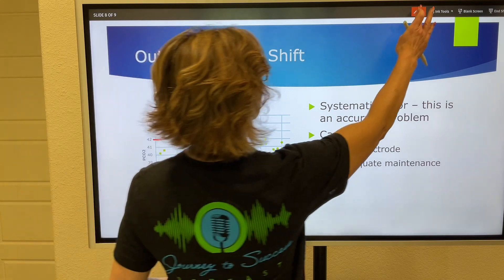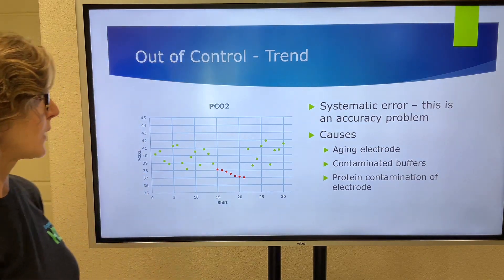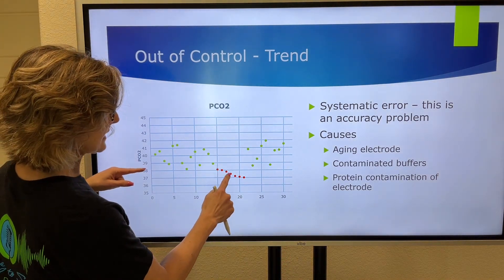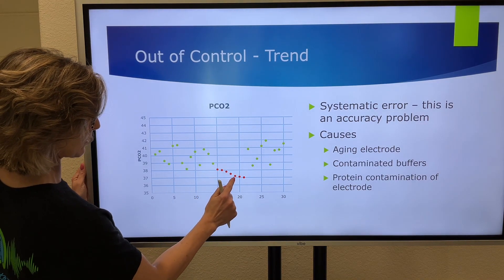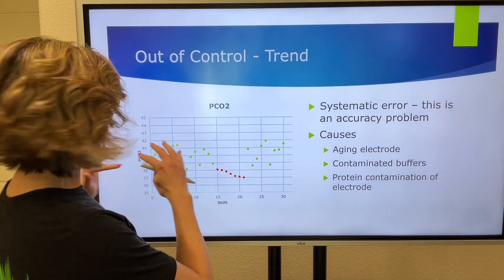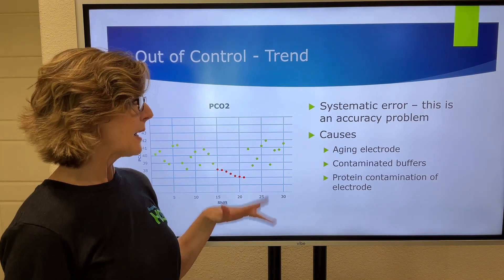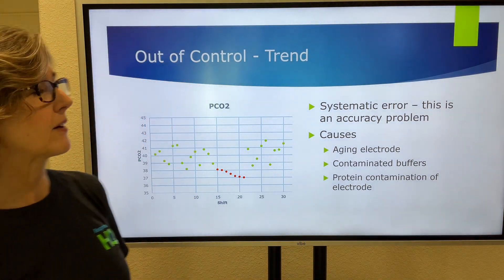One other situation to know about is trends. Trends are out-of-control situations. If you have five to seven consecutive runs where the values are trending in a certain direction — for example, each one is a downward trend — that is a trend situation, meaning the machine or electrode is out of control. It could be that the electrode is getting old, there are contaminated buffers, or there is protein contamination of the electrode.